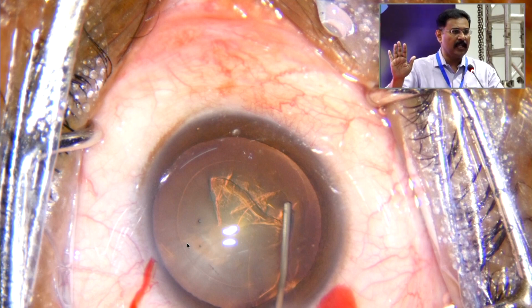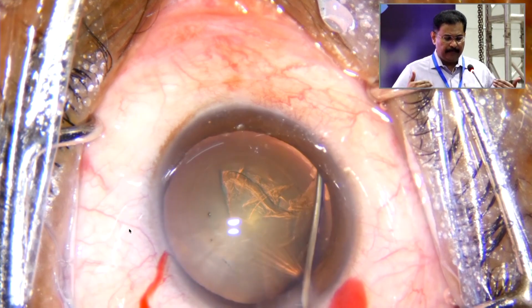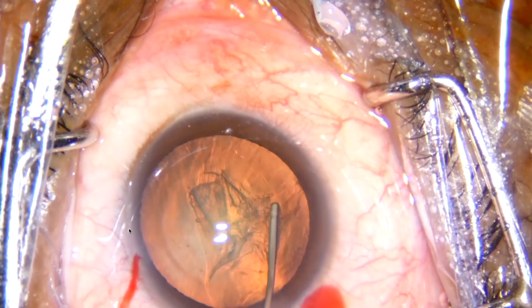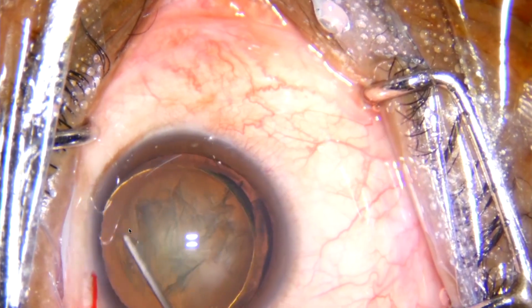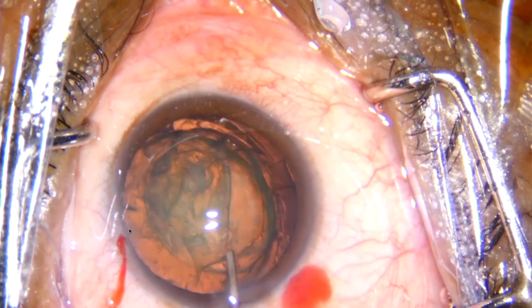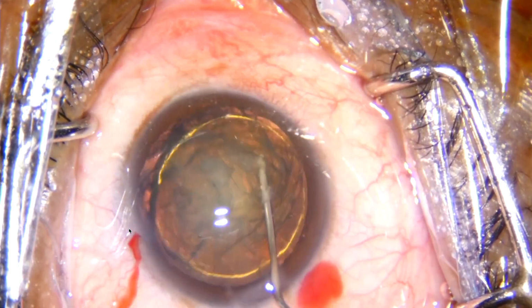If a fluid wave goes and you see the fluid wave passing the center, stop. I don't do it within 180 degrees close to me, and you also don't go very far away from you. So do almost 90 degrees or 45 degrees. See, this is how you dissect and delineate.